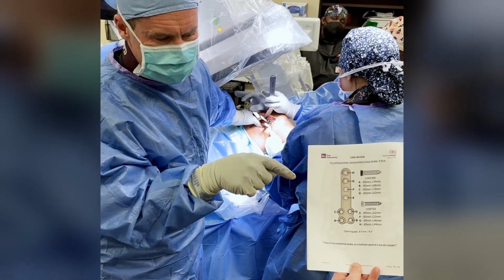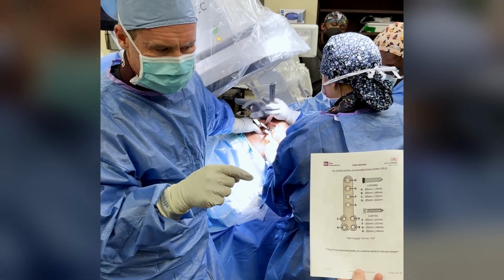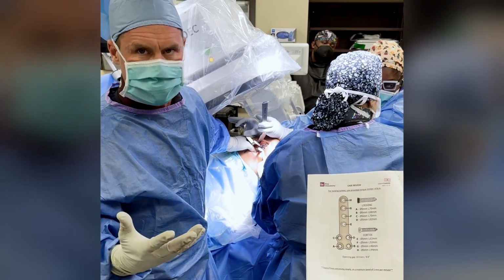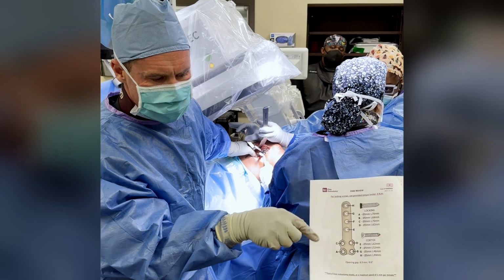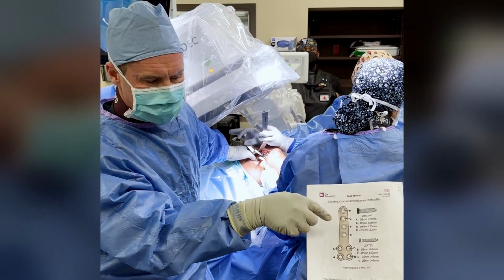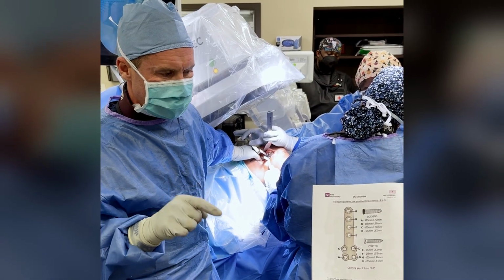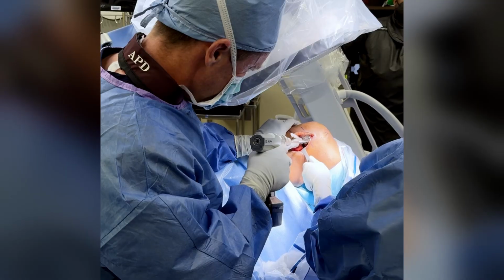What's cool about this is that all of our screws are predetermined based on the templating of this plan. So I just call out the letter of the screw based on which one I want for the plate. We don't have to measure the screws, they're already measured to the exact length that we want. We're using locking screws distal to the osteotomy. Those are not bicortical. And then we're using bicortical screws in the proximal holes. So everything's preset, and the length of the screws are predetermined based on our custom drill as well.